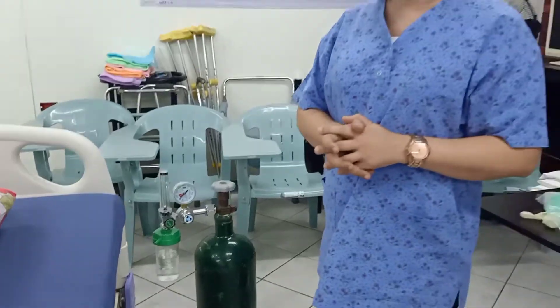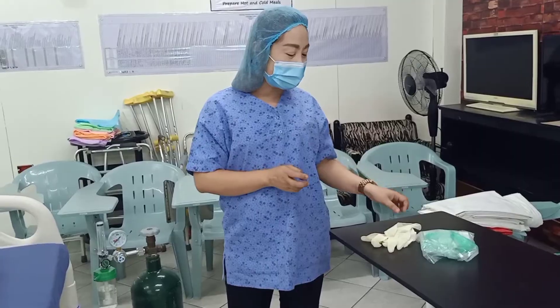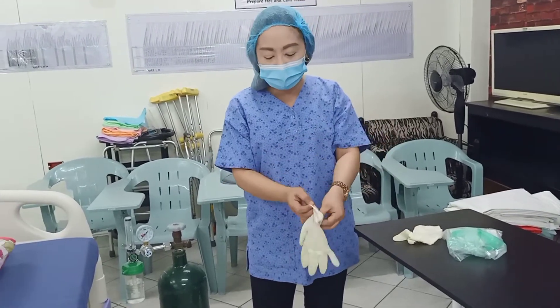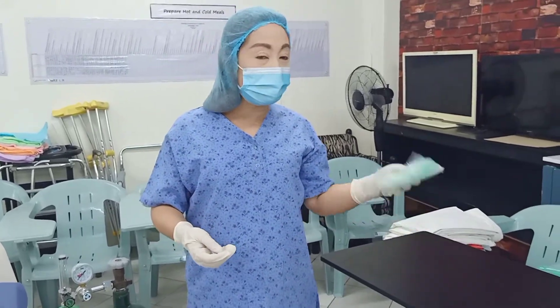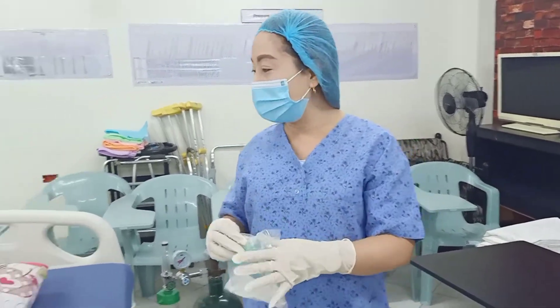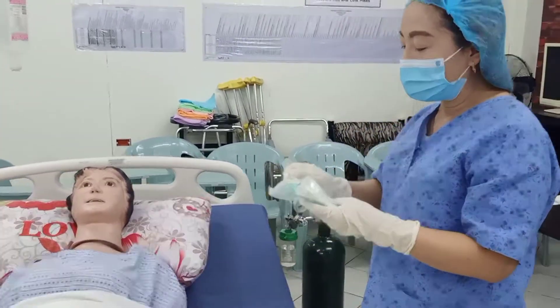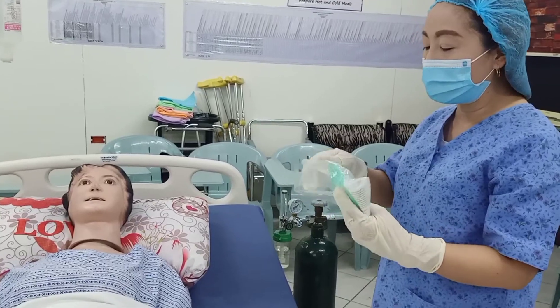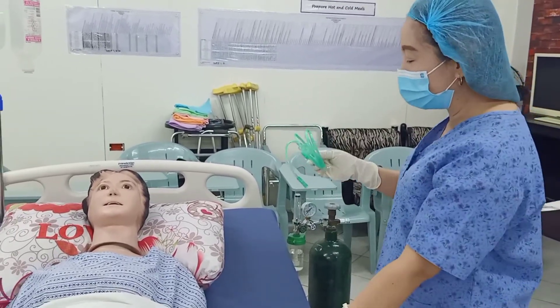The first thing that you would do is, of course, wash your hands — I have already washed my hands — and then wear your gloves. Get your nasal cannula and open the nasal cannula. The nasal cannula is sterile.